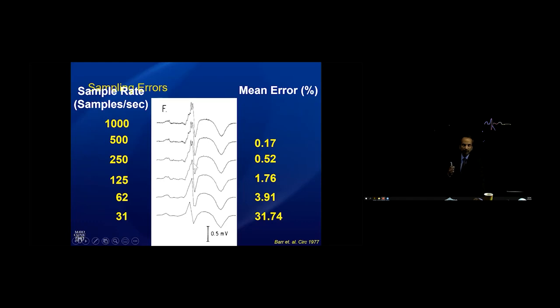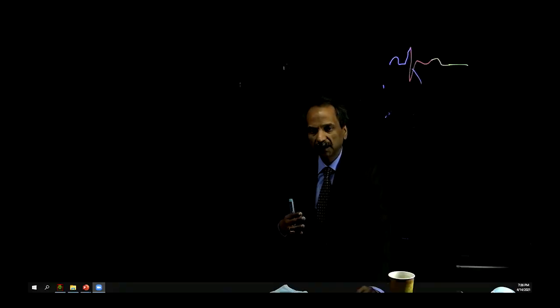Deshmukh pointed out, the notches, the glitches, the changes, the early signal, all could disappear because we just don't have the sufficient sampling rate to really bring it up. So that's a couple of things related in addition to what Dr. Mulpuru pointed out. So I see another question here.